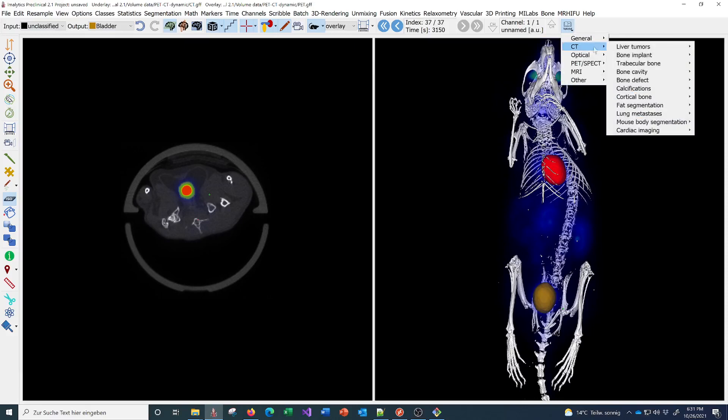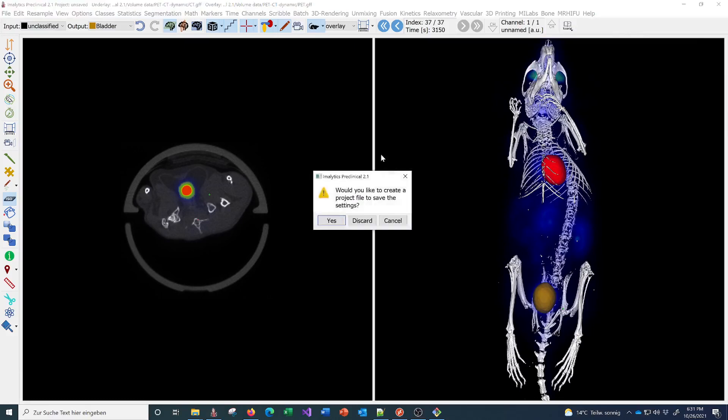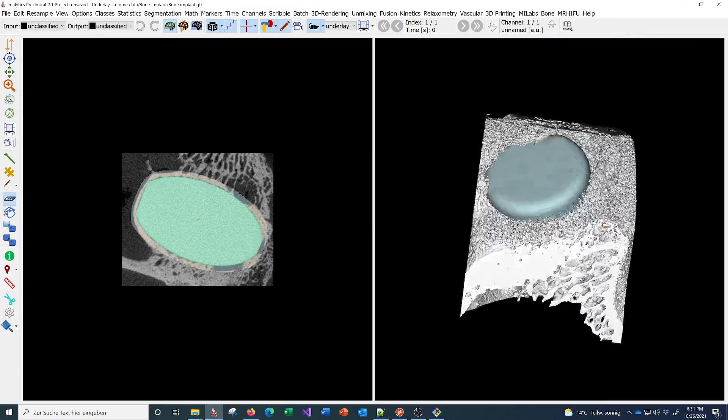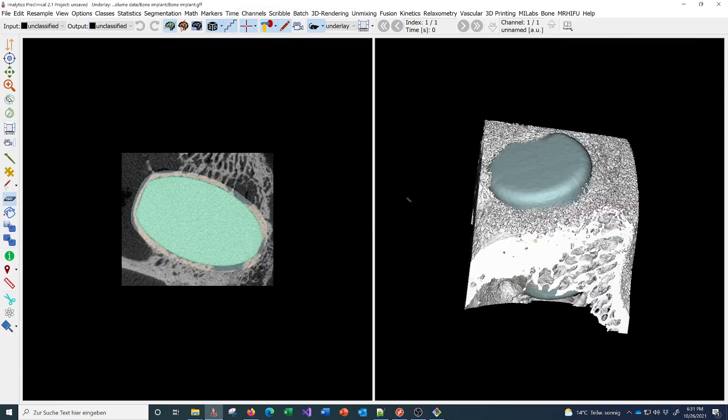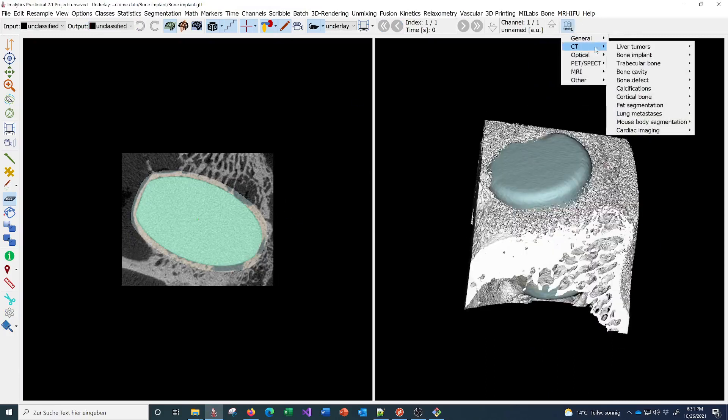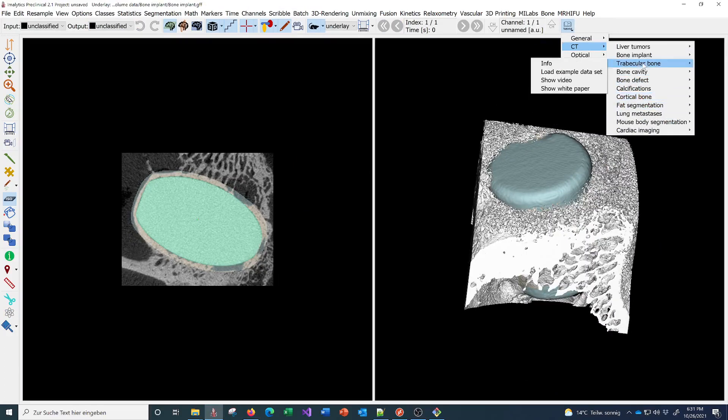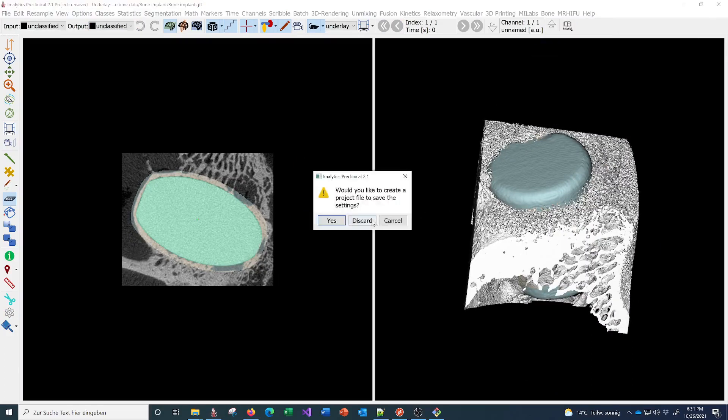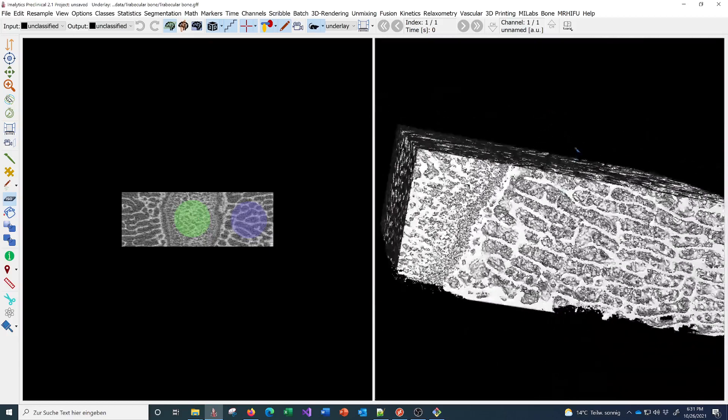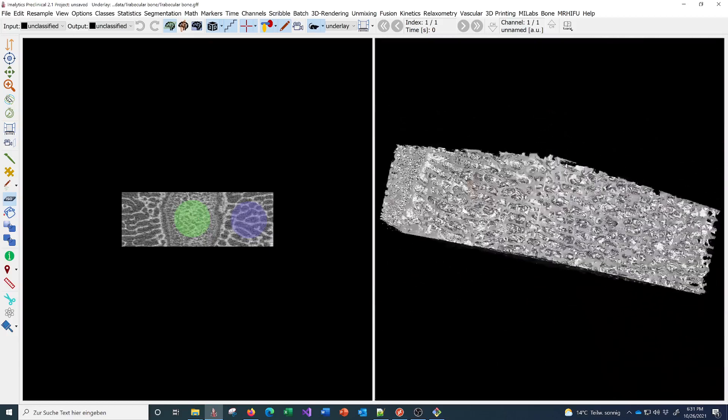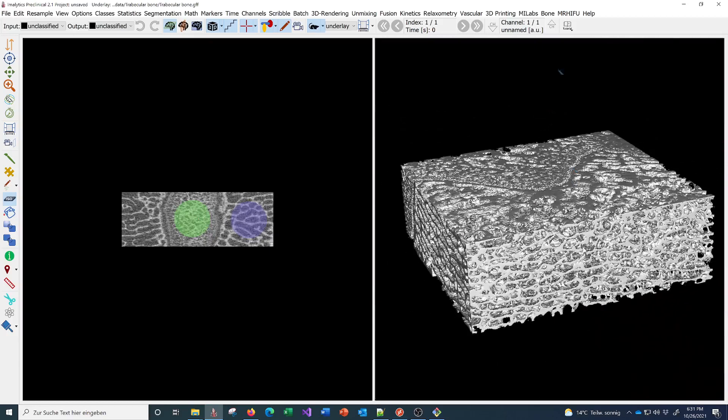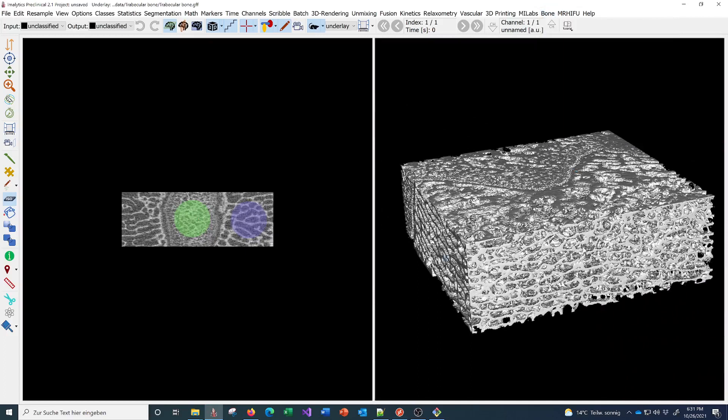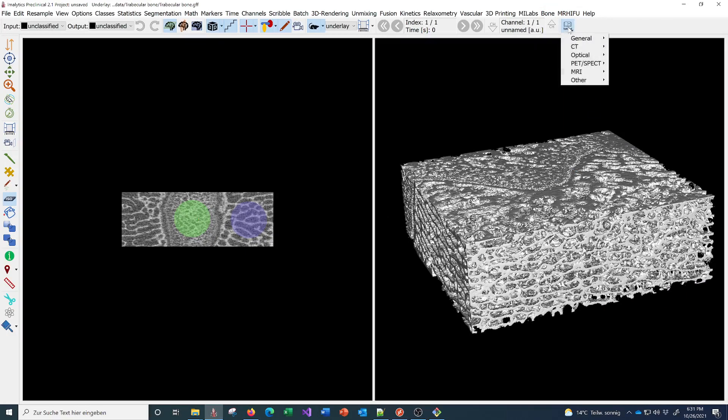For example, there are other tutorials also for a bone implant here or for trabecular bone. We have a very nice and fast module here for trabecular analysis.